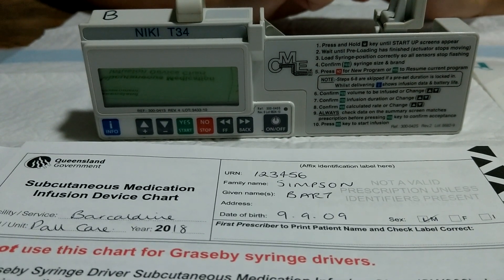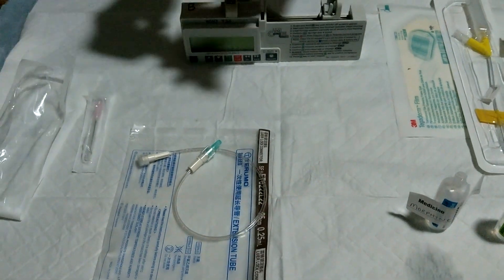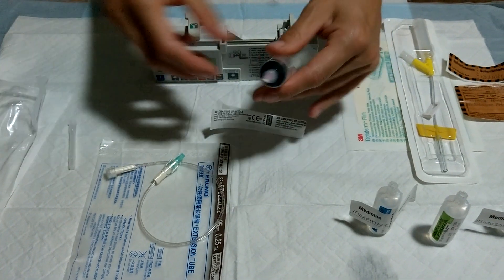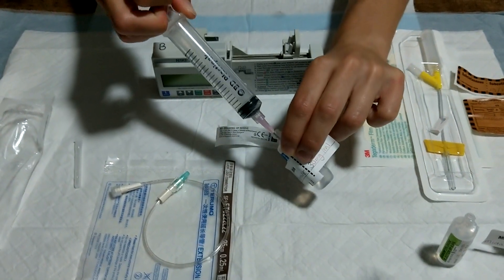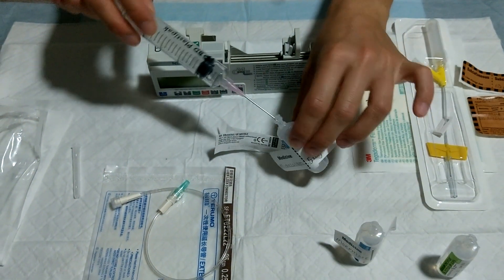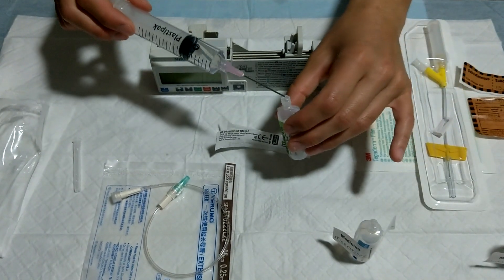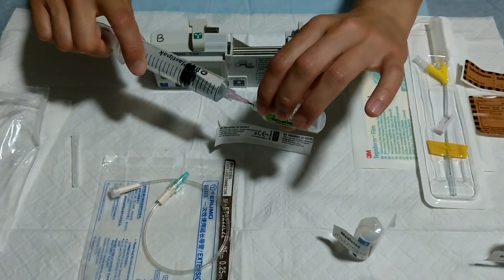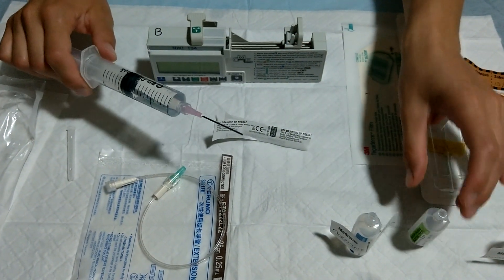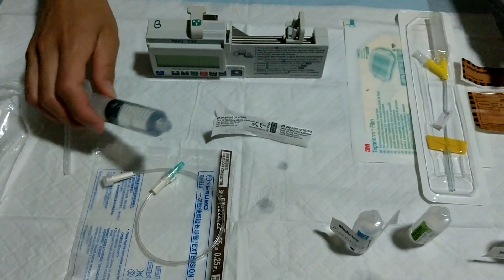We'll do a demonstration as if I was setting up the pump in real time. That's for the complete method.